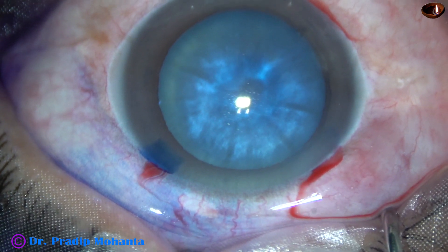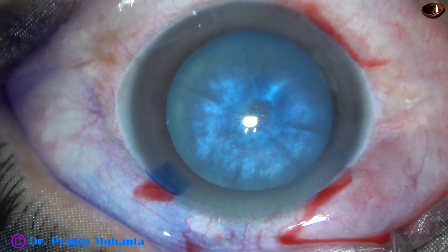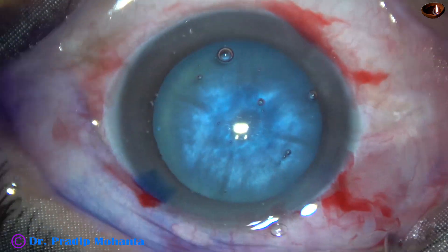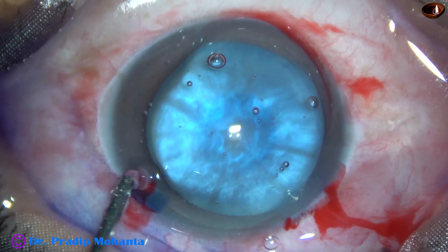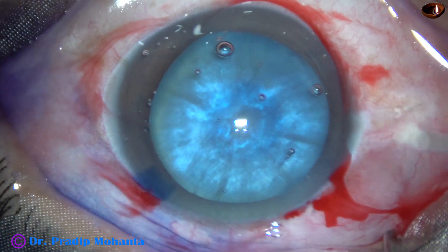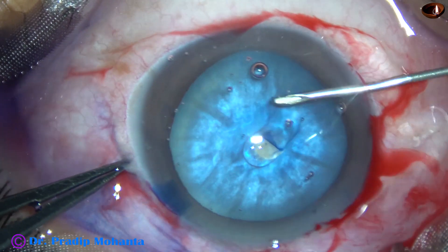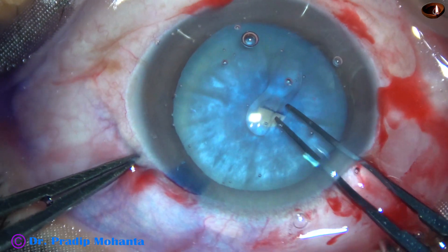2% hydroxypropylmethylcellulose (HPMC) is used to fill the anterior chamber. I do not use sodium hyaluronate in intumescent cataracts. The HPMC is applied over the corneal epithelium for better visibility. I then take a 26-gauge bent needle to incise the anterior capsule and raise a C-flap.